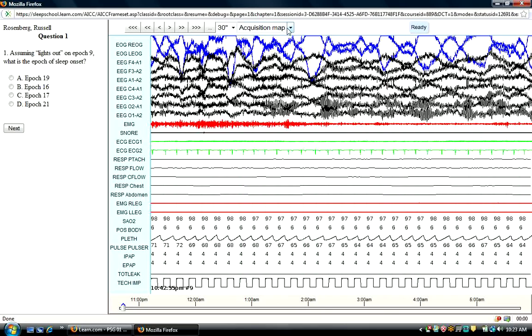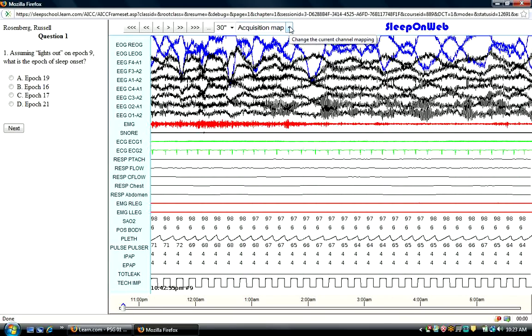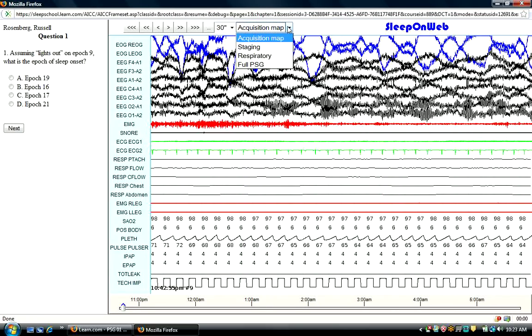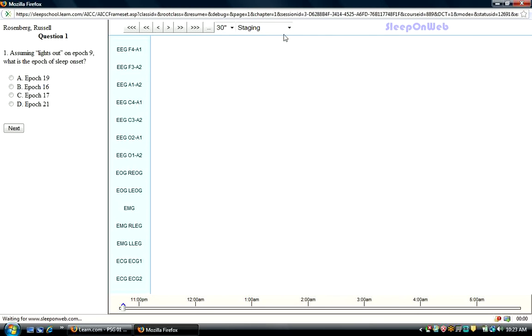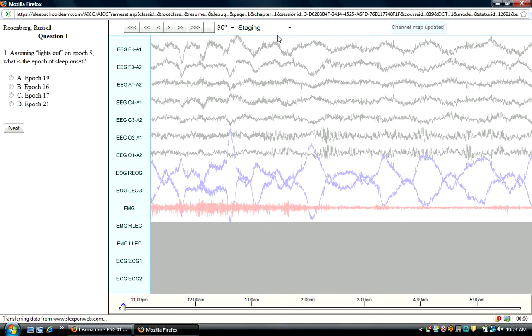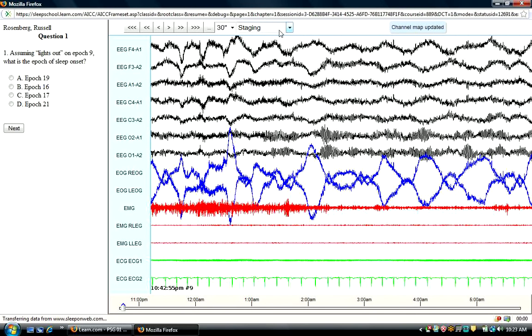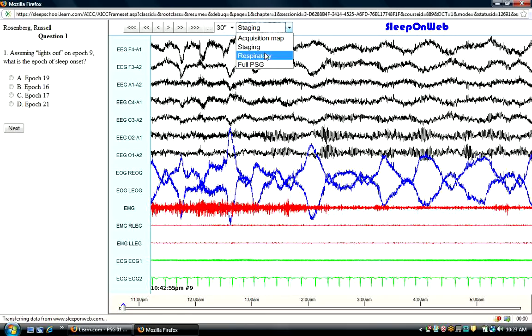First, I'd like to orient you to the different montages that are available for you to view with WebPSG. It will always default to acquisition map, but if you look at the pull-down menu, you can go to a staging montage.